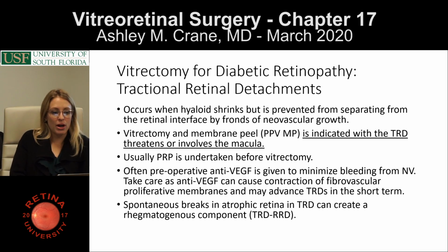And also, when you're doing the PRP, make sure to not get extremely close. Stay a couple disc diameters away, and you don't need to do the whole PRP in one day. I would say be more cautious with the amount of spots you're putting in than you would with somebody else, because it can cause crunching.